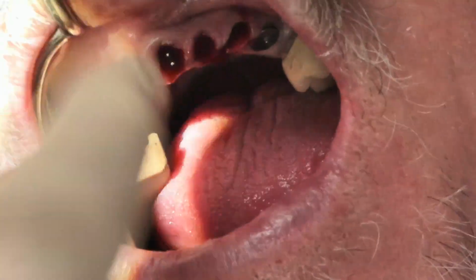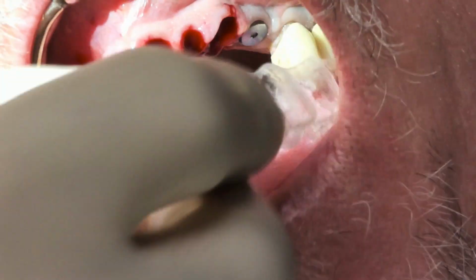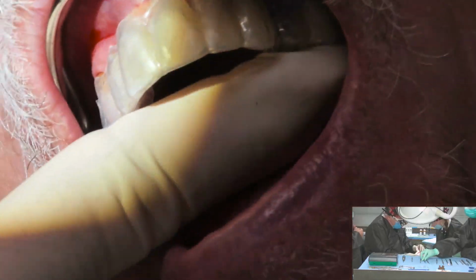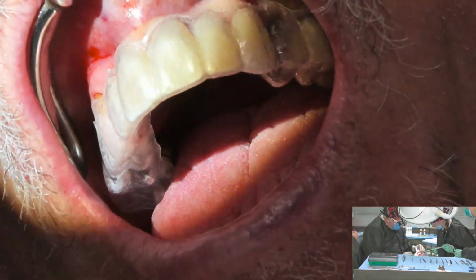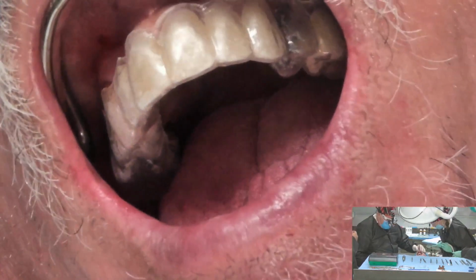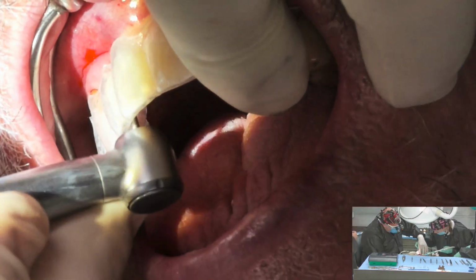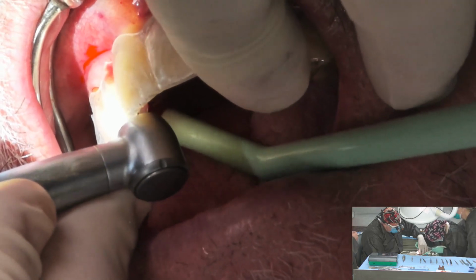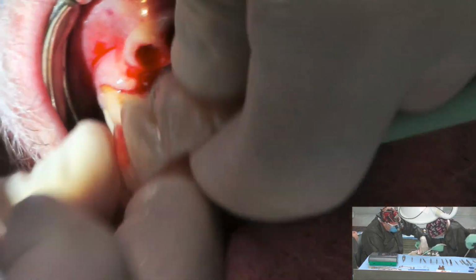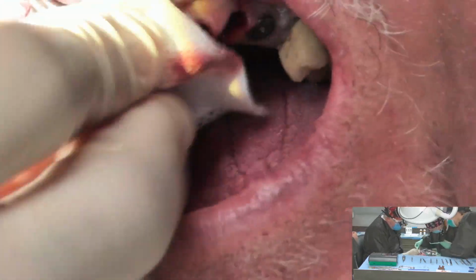So the first thing I'm going to do is have Alan, go ahead, open for me. Open up for me. There we go. I'm going to put like a little football mouth guard in, okay, Alan? So you can see now, this is my surgical guide, but it's also my provisional restoration. So initially, Ina, take this from me. I'm going to come in at number 7 area, and I'm just going to notch my tissue a little bit where the correct emergence profile should be.